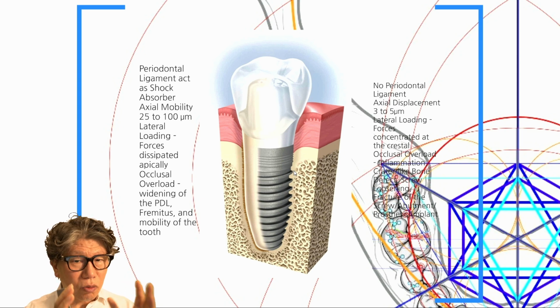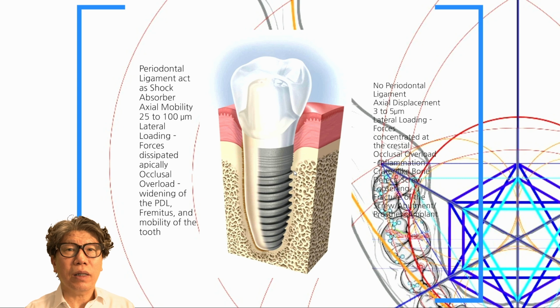Also, most are made from pure titanium, and HA-coated implants are sold as secondary. Thus, the most important thing for us is inert material, and it must not rust. Rust eventually emits harmful substances to the bony tissue. Therefore, almost every time, it seems a conclusion has been reached to use inert material.